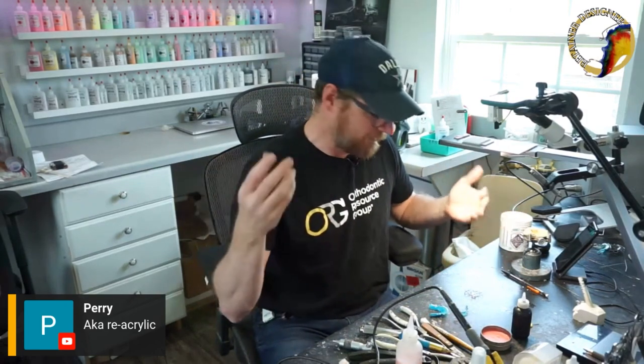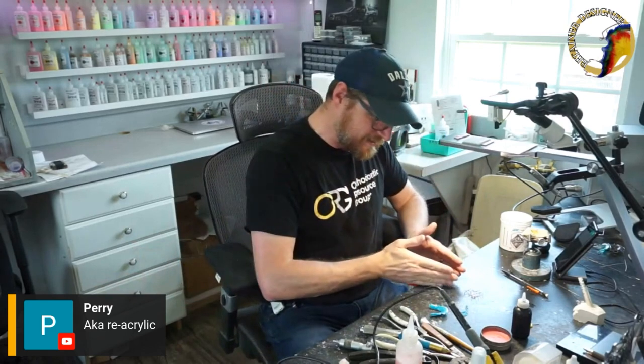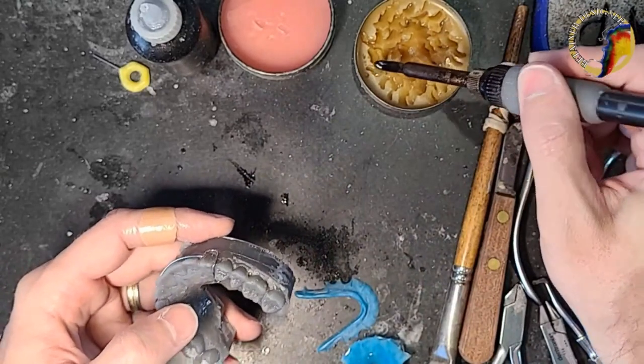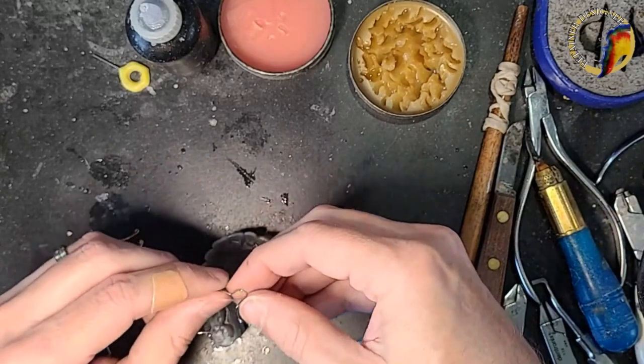If it fits the model I did my job; if it doesn't fit the mouth the model was wrong. That's why it's always good to ask for the retainer back — you can scavenge the wires, reuse them, and it saves time. Someone called it 'reacrylicing' — I like that term. We're not bending wires because we already bent them once; we're just stripping off the old acrylic and putting on new.